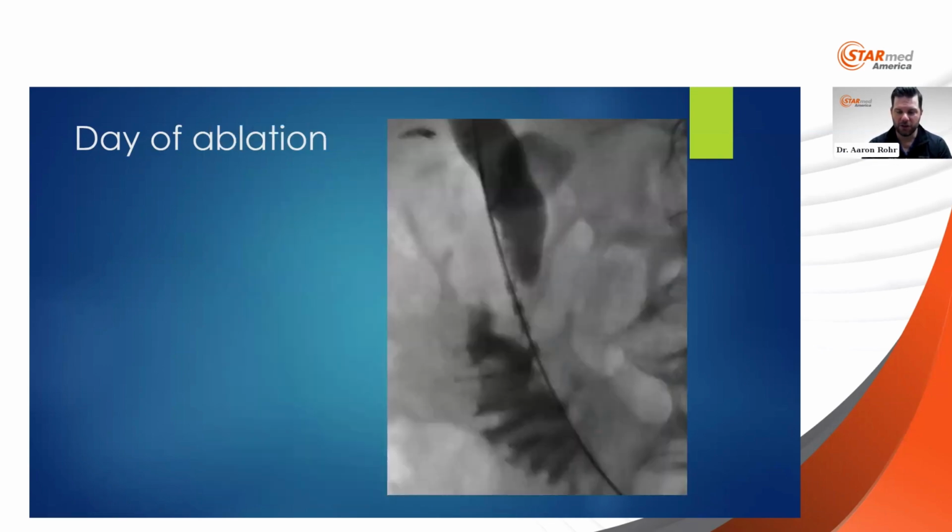So focal differences here: 1, not anastomotic. 2, it's an inflammatory process that resulted in this focal process. 3, it's a little bit larger. So we were able to see that diagnostically on our initial placement with the 8 French and say, okay, this isn't our typical 11 millimeter ablation device. We're talking something a little bigger here.